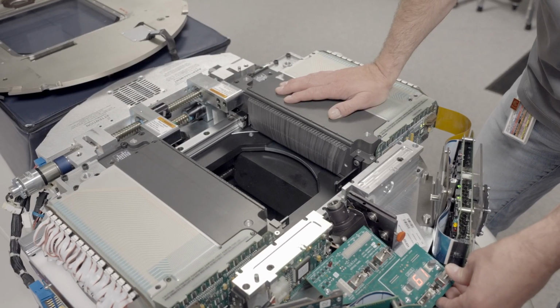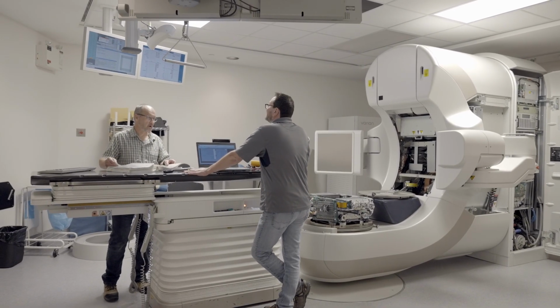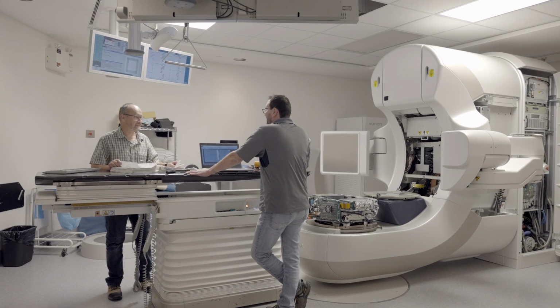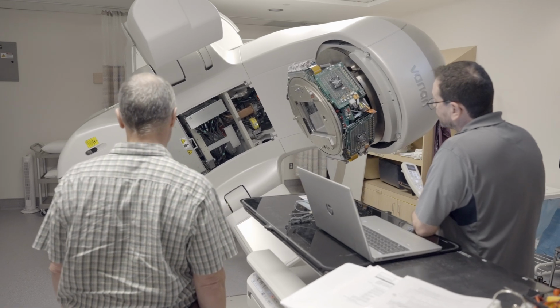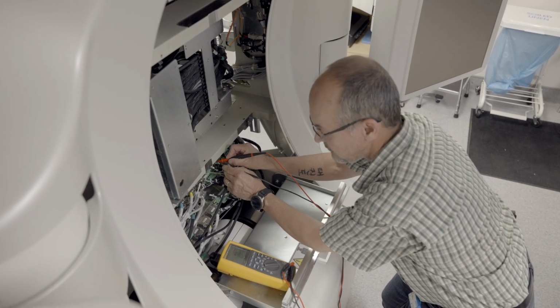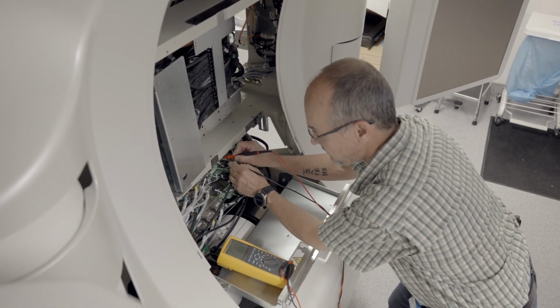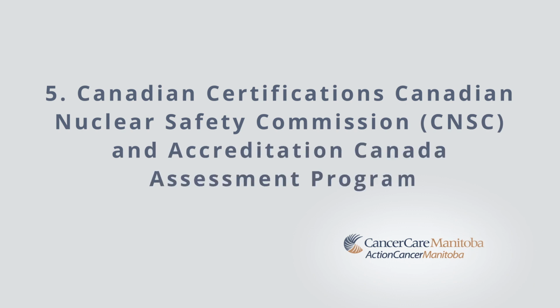These linear accelerators, also known as LINACs, produce radiation by using high-energy radio frequency energy to accelerate electrons into a tube-like structure called an accelerating waveguide. These complex machines have a preventative maintenance plan for their mechanical components, radiation monitoring systems, and their pulsed high-voltage systems. We do careful surveillance and maintenance of our equipment and manage a parts inventory so our patients benefit from less unscheduled machine downtime.